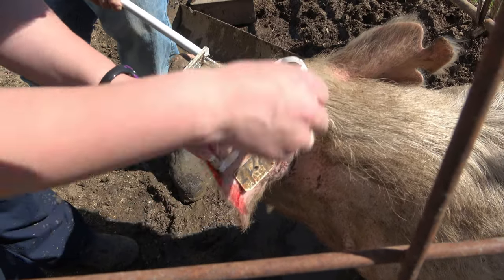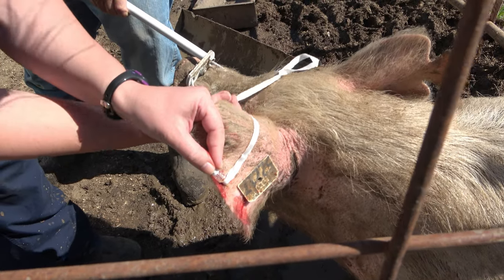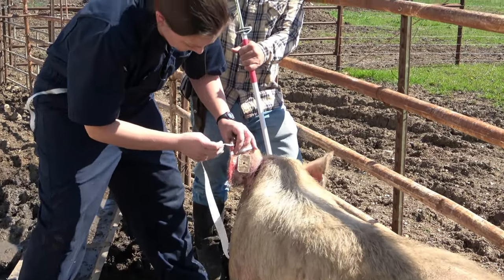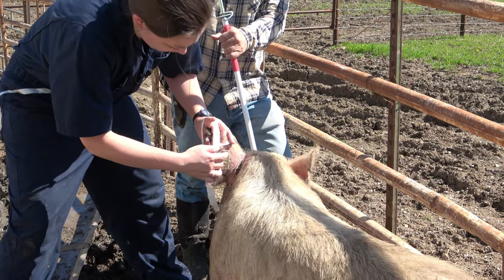It's all right, sir. And then we're gonna go ahead and just tape around your ear. We want our tape not too tight, but not too loose. All right, so I've got my first little tape on here, securing the catheter in place. I like to take a second long tape to secure it from the front.